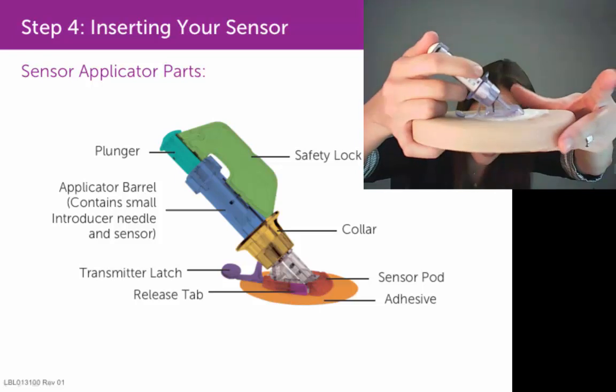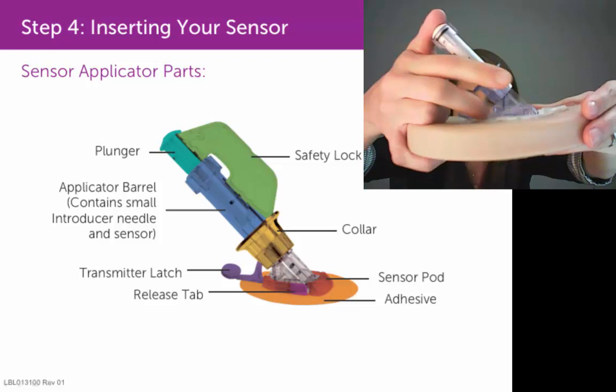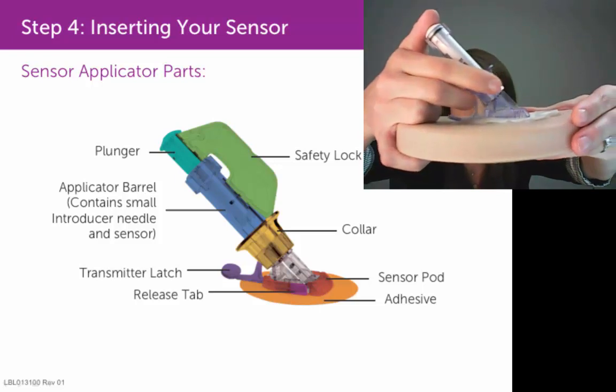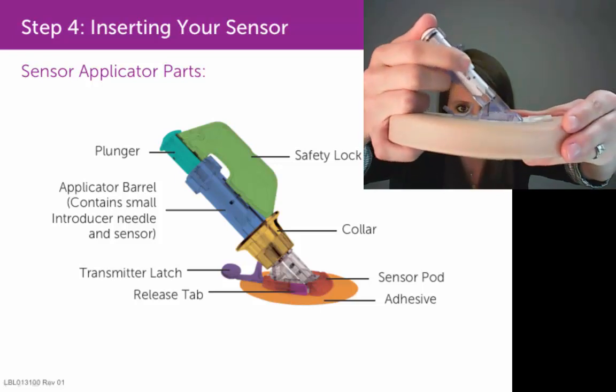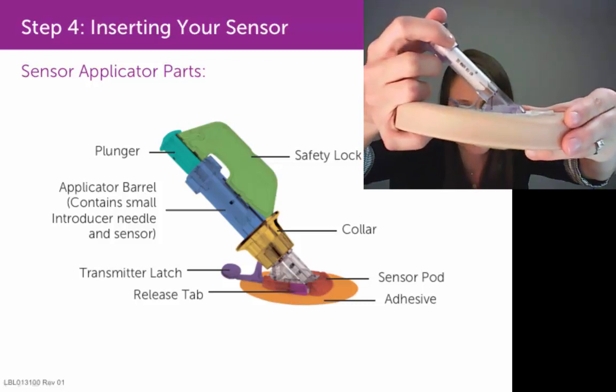You can let go of your skin, but continue to keep your thumb on top of the plunger, and now move your two fingers below the collar. Then glide that collar all the way to the top of the applicator barrel until you hear two clicks.